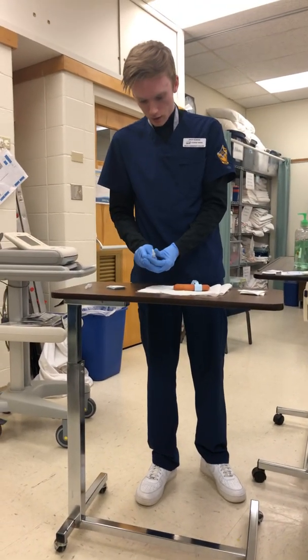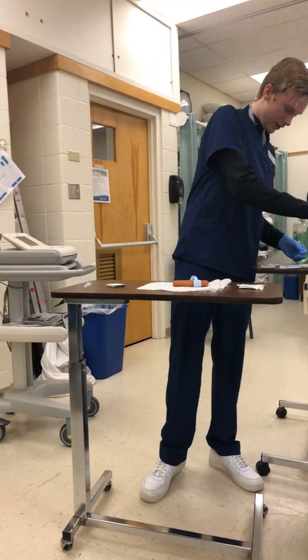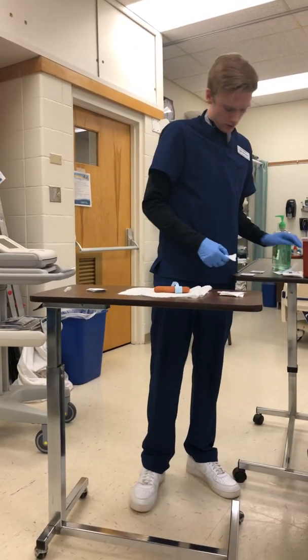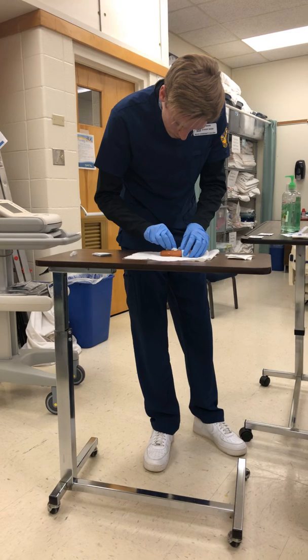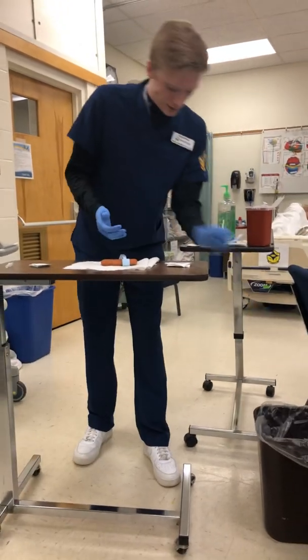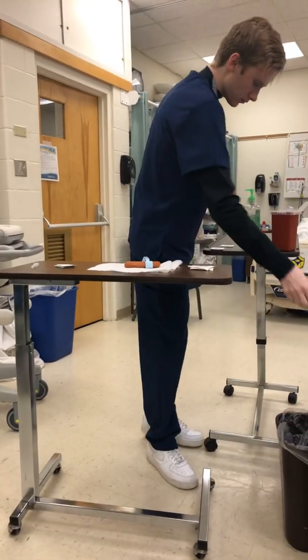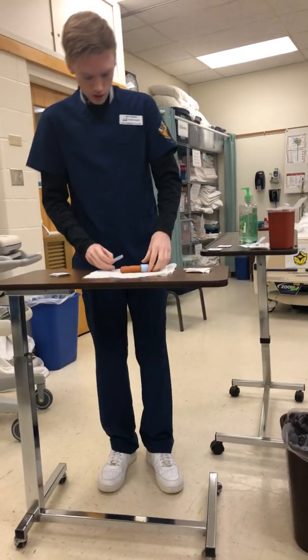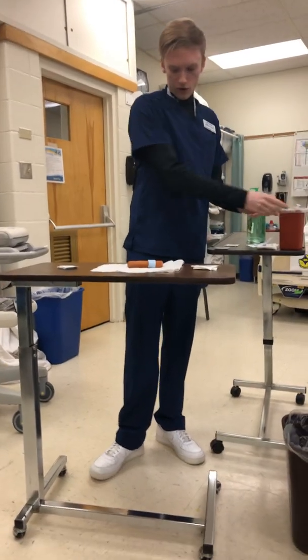And we have a safety lock on the needle. And then we would discard. And then use a cotton ball or some gauze to clean up and then assess the site. That's done. I would remove my gloves and wash my hands and place the patient in a comfortable position, and then give the patient his call light. And is there anything else that I can do for you? No, that's great, thank you. Alright, wonderful.